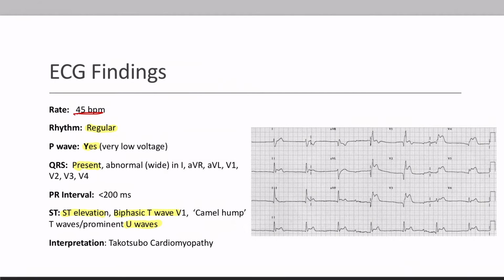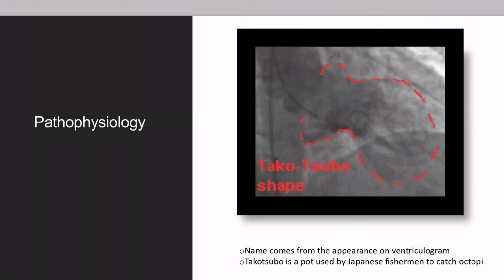So our interpretation here can't really be made just from the ECG, but taking into account the entire presentation of the patient, we would actually classify this as Takotsubo cardiomyopathy. I'll explain why. So onto the pathophysiology.